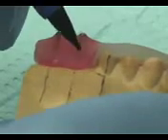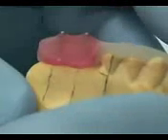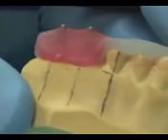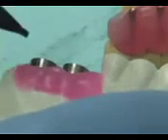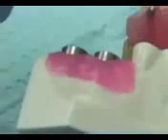And so by making that contour on our radiographic guide at the time the surgery is done, the surgeon can place that guide on the patient once they have laid the flap in this area. And then when they go ahead and contour the crest of the ridge prior to placing the implants, they contour the crest of the bone, the ridge crest, using the ridge crest preparation guide.